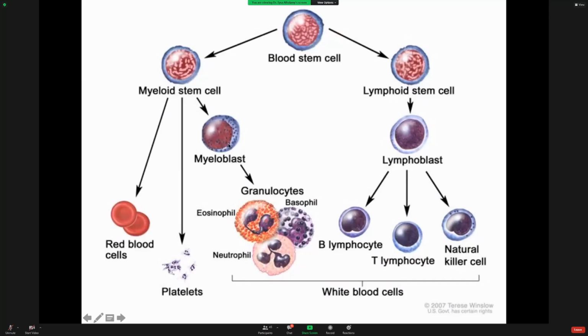لكن الميلويد can give us platelets, red blood cells أو الميلوبلاست الميلويد lineage في granulocytes اللي هو البيزوفيل والإيزينوفيل والنيوتروفيلز. This is the neutrophil segmented. This is the basophil, usually darker purple color. بنفسجي لونه يجي البيزوفيل. Eosinophil, it's strange colors. You can look at it for the cytoplasm. Usually it's orange in shape.